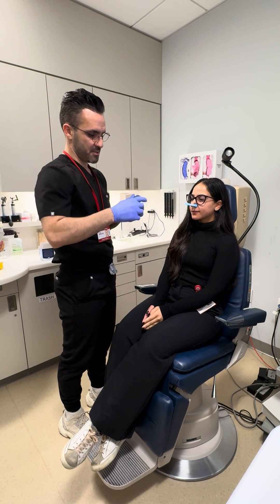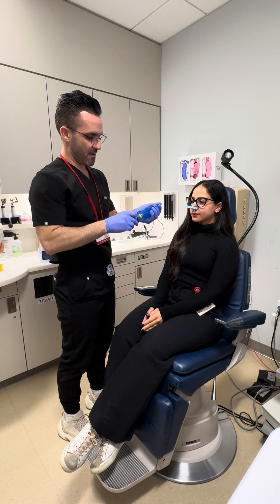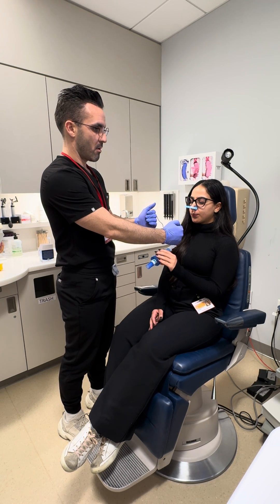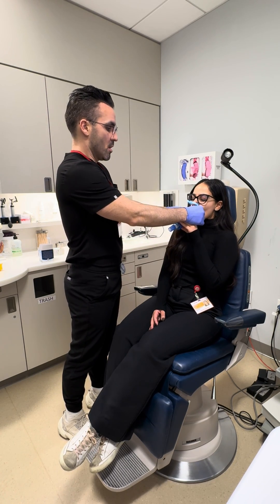Alright, make it a little easier, right around 75. Low. Go, go, go, go, go, go, go, go, go. Stop, bite and suck in. Good, excellent.